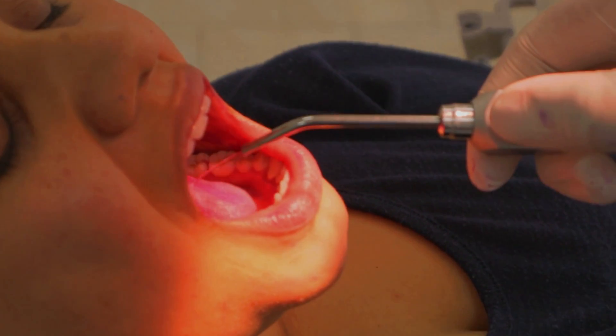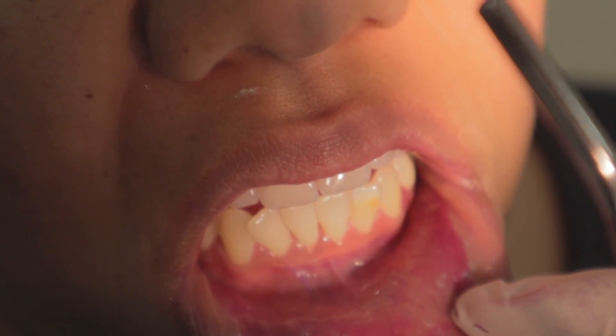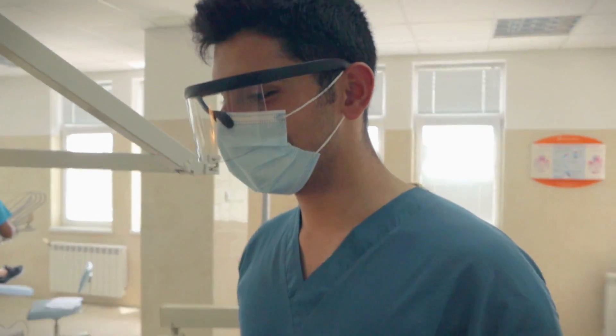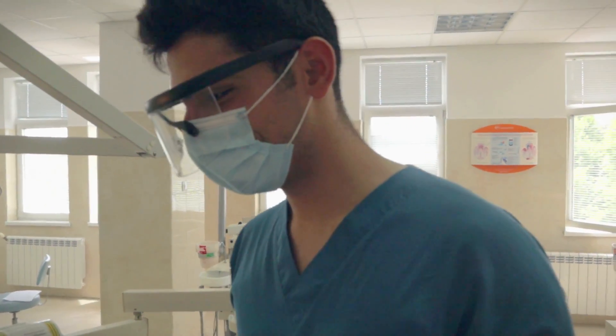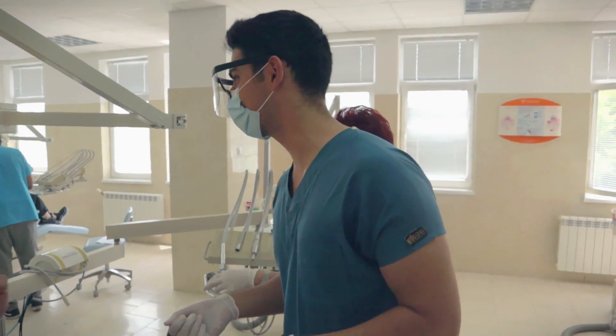That was the end of cleaning. I asked the patient to rinse her mouth. The final product shows much less calculus all around and much less debris. How do your teeth feel? 'A lot better when I run my tongue along my gums.' Do they feel a lot cleaner? 'Mm-hmm.' How do you think I did today? 'Good.' Give me a rating out of 10. '10 out of 10.' Thank you so much, I really appreciate that. Thank you so much for coming in today.